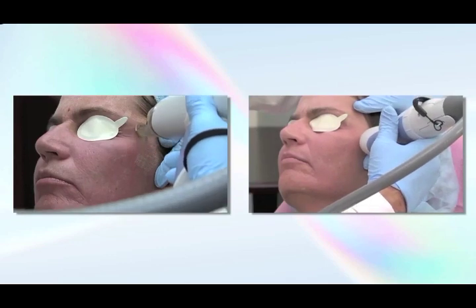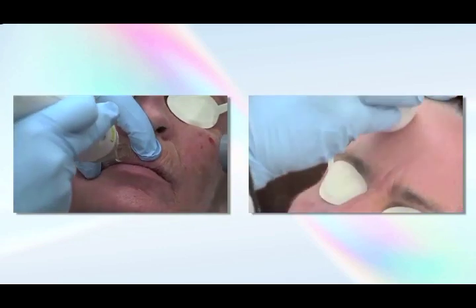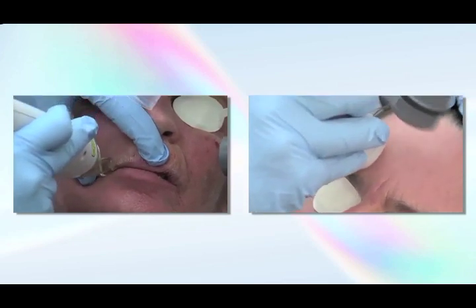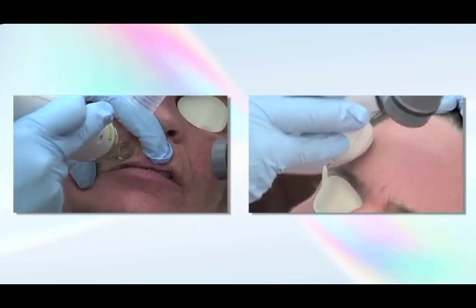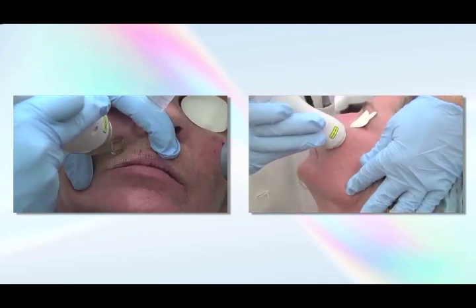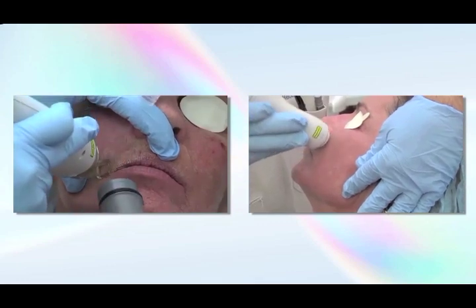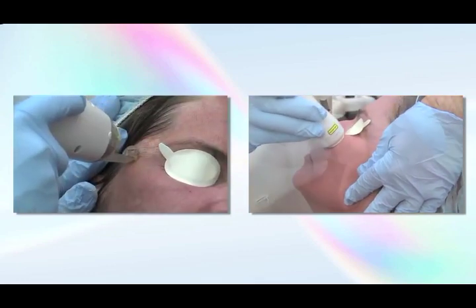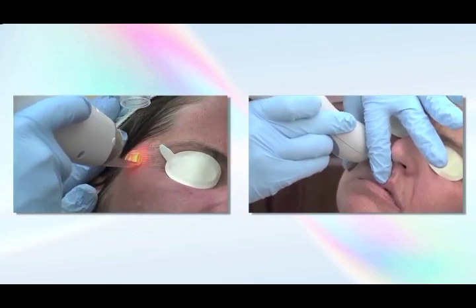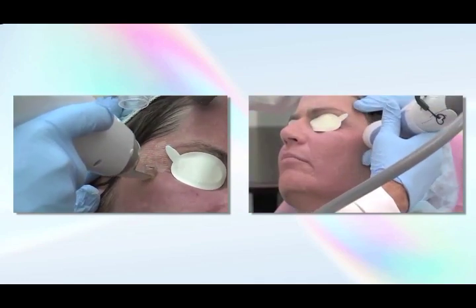A popular treatment nowadays is combining the fractional 1540 with the erbium YAG 2940 fractional ablative in the same treatment. This allows us to get a great percentage of surface coverage with both coagulation beams and with ablative beams. This allows for more rapid reepithelialization and is a shorter downtime for the patient. Often we do a treatment on Thursday and the patients are typically back to work on Monday.